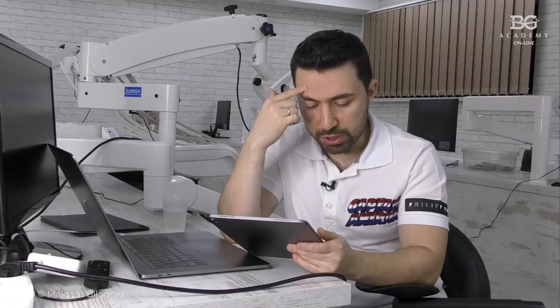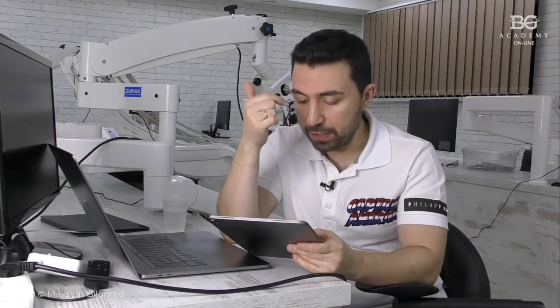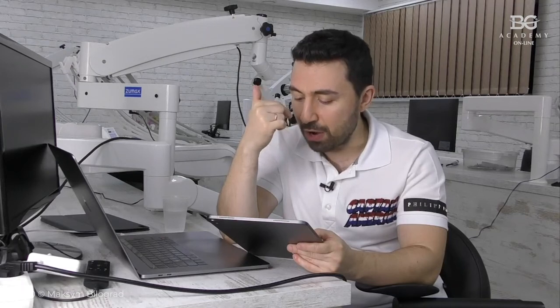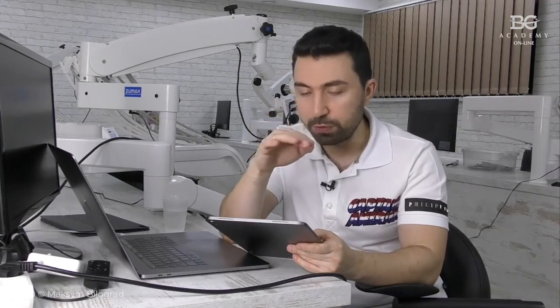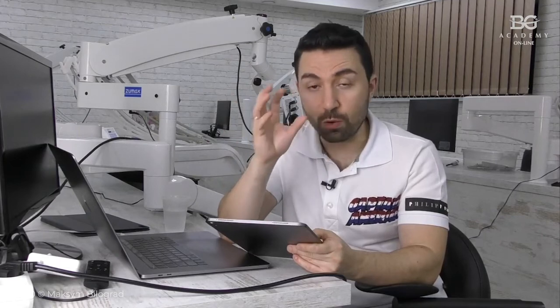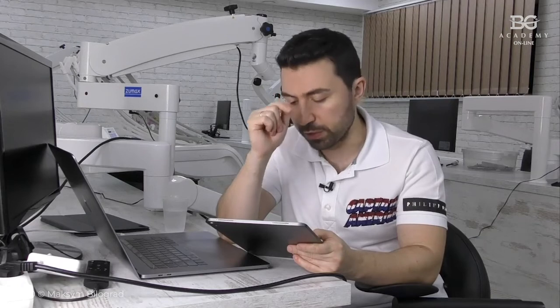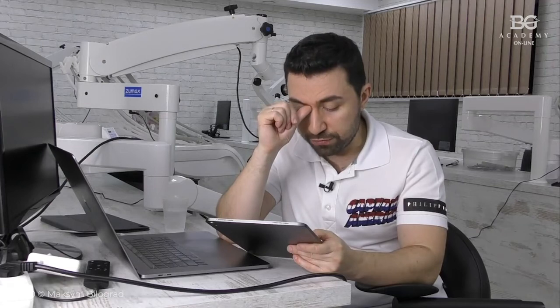Another question: would you personally be happy to have lower incisor edges on unsupported ceramic veneer? Ceramic veneer is already supported by bonding to enamel. When you bond your ceramic veneer, it becomes like a whole piece with the tooth, one biomechanical substrate. So it's supported. This is important to understand. Or would you prefer a crown, to have supported ceramic?